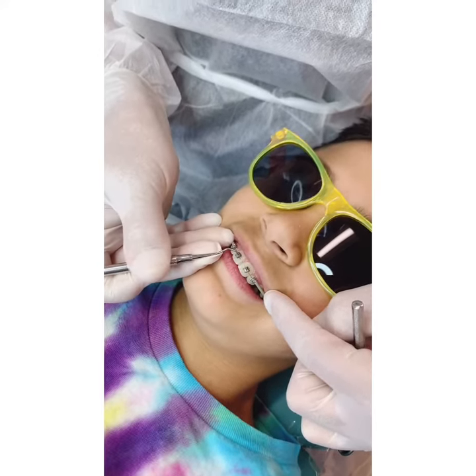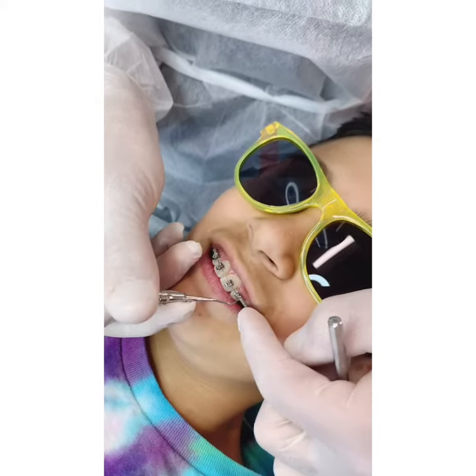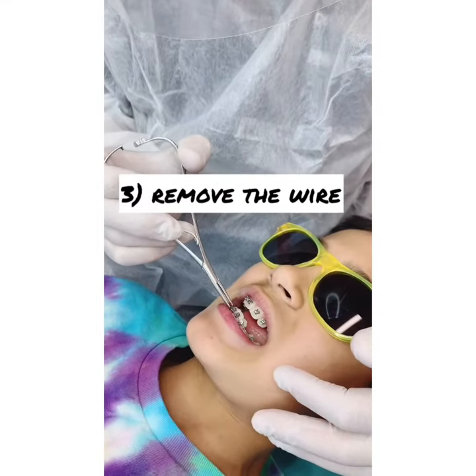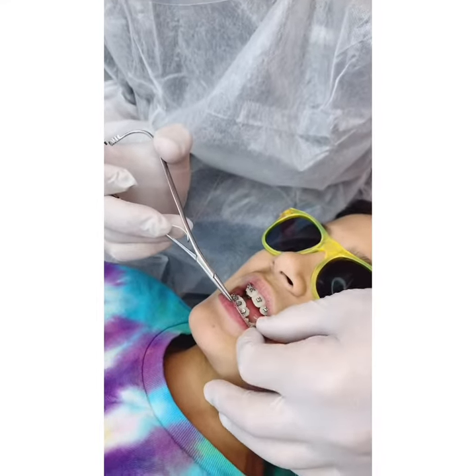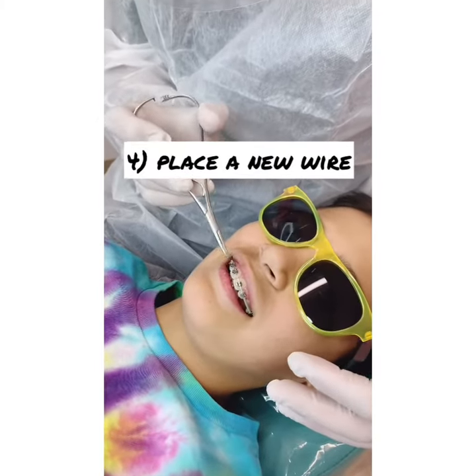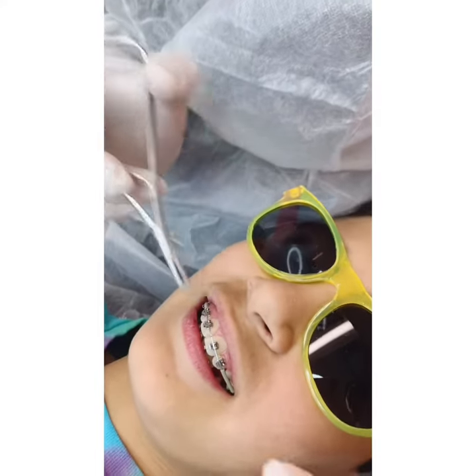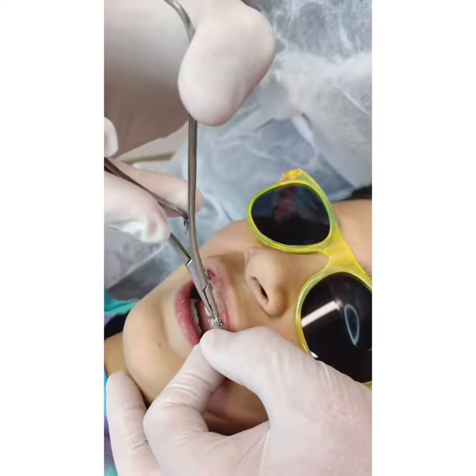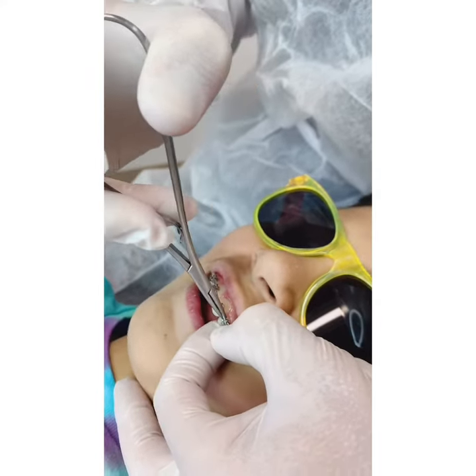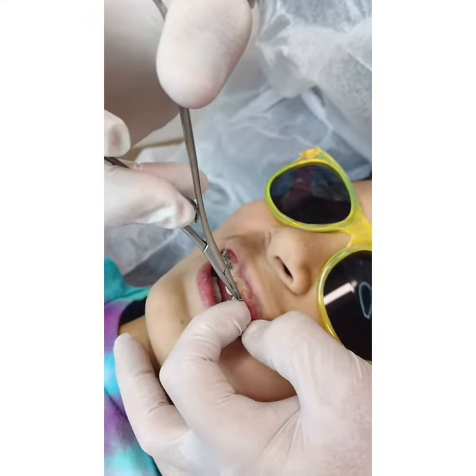Opening the doors is easy. After opening the doors you can just lift the wire and slide it out of the mouth. Next we're going to insert a new wire and it just slides into the slots of the braces. And then we just close the doors.